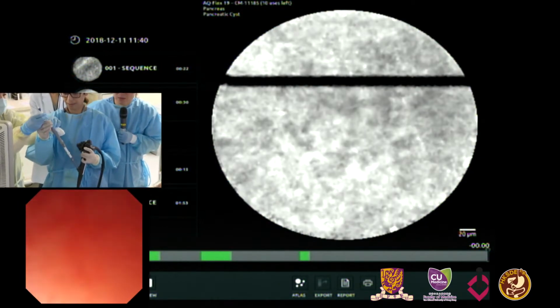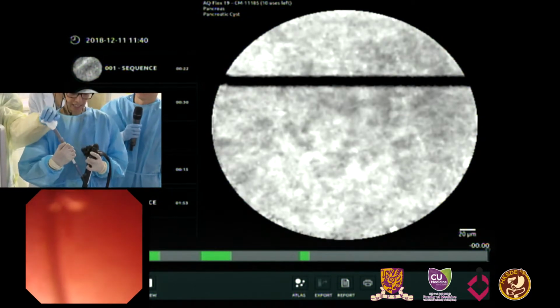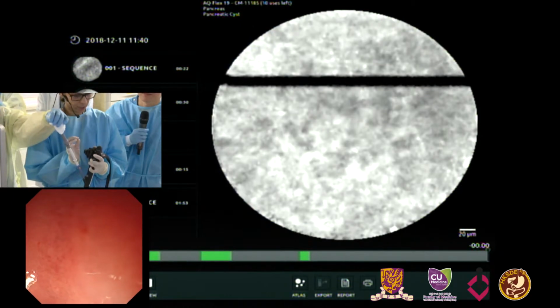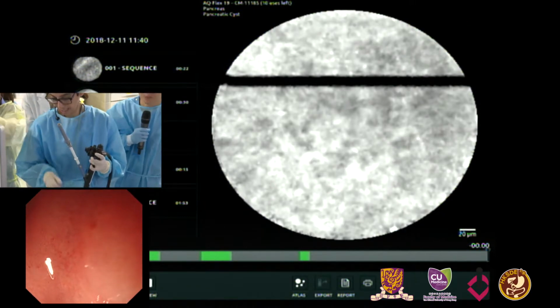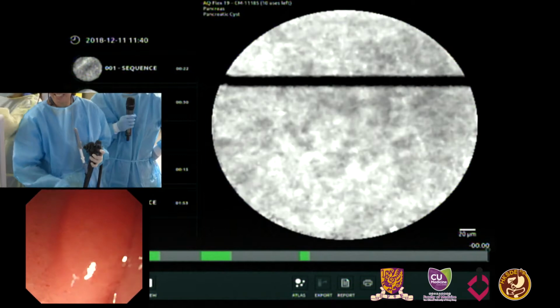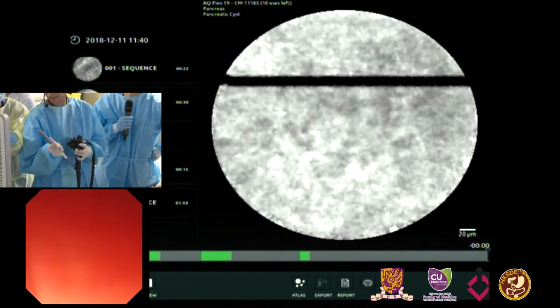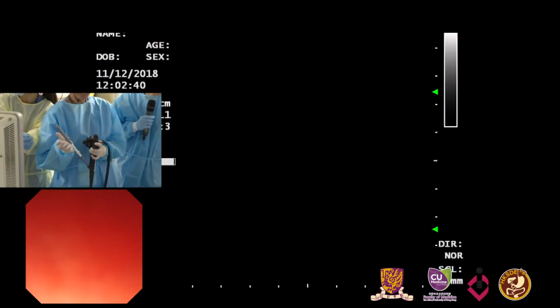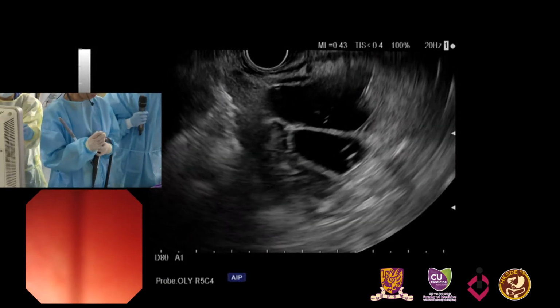I was going to say with the microforceps, the couple of studies that came out this year, one was from University of Colorado and another was a multi-center study. I think the lead author was Dennis Yang from UVA in the States. But they claim that their yield for diagnosis was higher than cytology. I think they got 50% versus maybe 8 or 9% on cytology. So I don't know if you can close up on the forceps now.